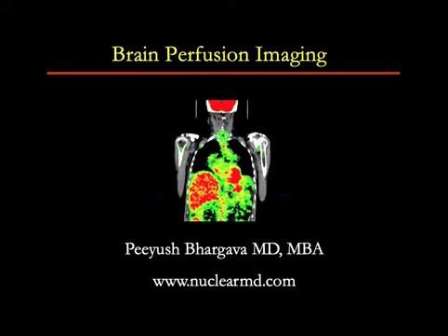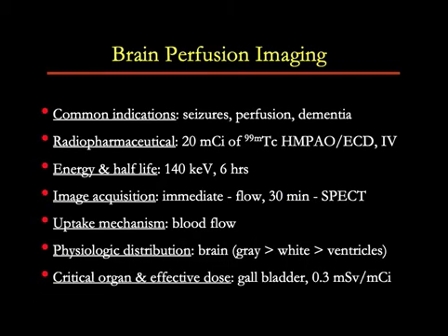Let's review the clinical imaging protocol. There are several indications for evaluating patients with brain perfusion imaging and brain SPECT. These include evaluation of patients who have complex partial epilepsy to identify the site of seizure focus so that it can be surgically resected, patients who are being evaluated for brain death, and patients who are being evaluated for dementia.